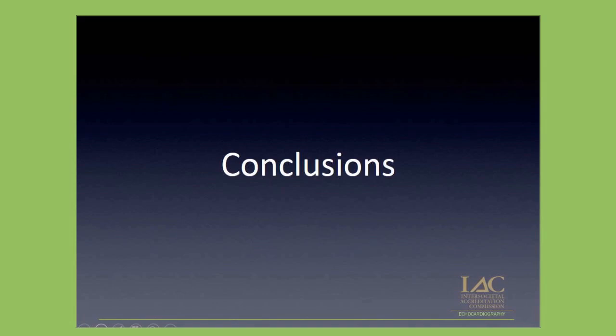First of all, the definition of CTRCD, drop of absolute 10 points of EF below 53%. Two types of CTRCD, type 1 and type 2. I have explained to you the importance of using 3D echocardiography for the surveillance of subclinical LV dysfunction and CTRCD. I have explained to you that there are two modalities that could be used, MUGA and MRI. And finally, I have walked you through the practical algorithms that we incorporated in the expert consensus, helping you sort out your patients on daily basis.